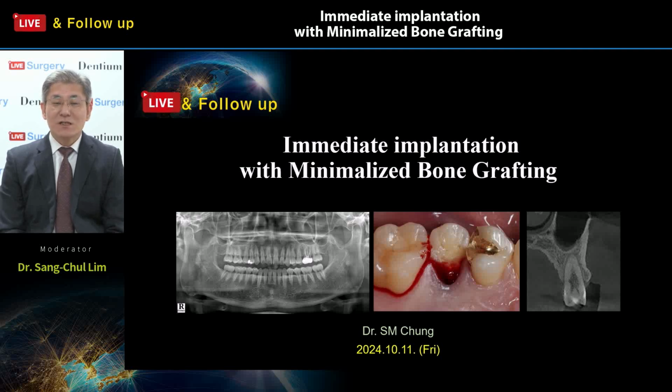Today's surgery is once again performed by Dr. Chung. I extend my gratitude to him. Today's topic is immediate implantation with minimized bone grafting. I'm confident that through this surgical video, we will have a great opportunity to learn how to handle the Bright tissue level system on extraction sockets, especially when we have immediate implantation. I hope your clinical skills continue to improve every day.